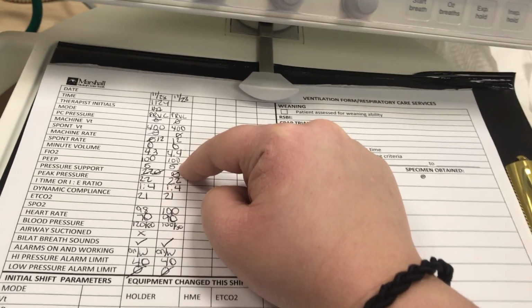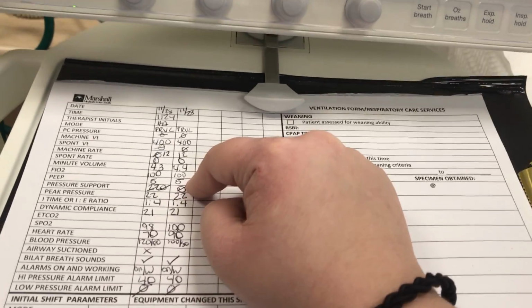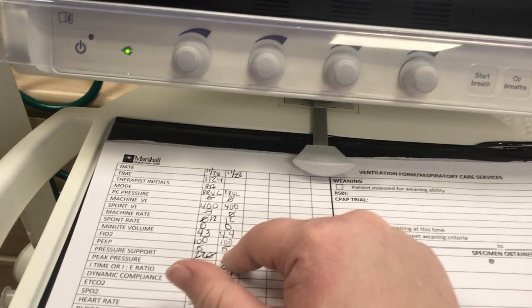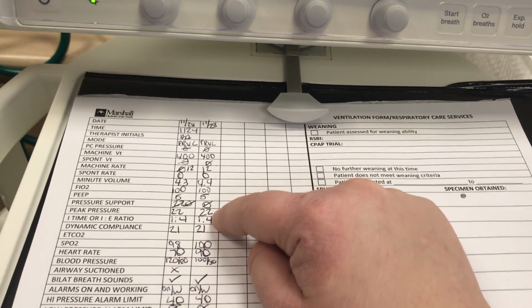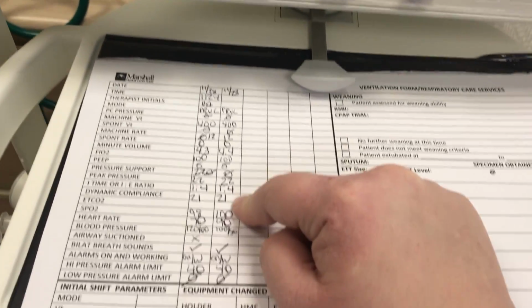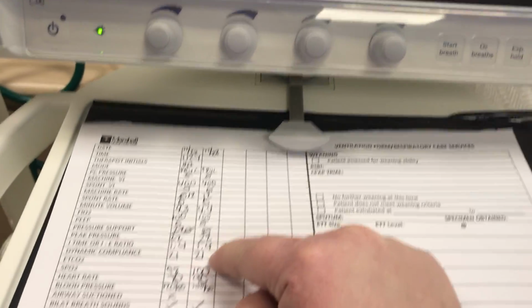My FiO2, I only have one air source, so it has to run at 100%. My PEEP is also at the bottom. There's no pressure support in this mode, so I'm not going to have it. The peak pressure is 22, so I'm going to write that there. My I:E ratio, which is 1:4. My dynamic compliance, I'd go to that page and see that it's 21.